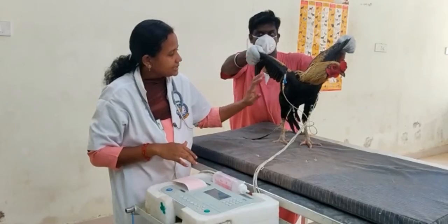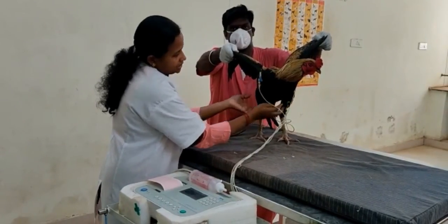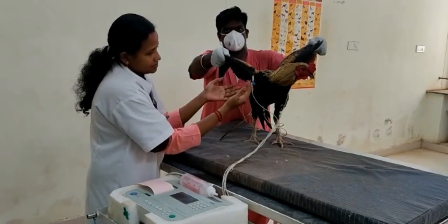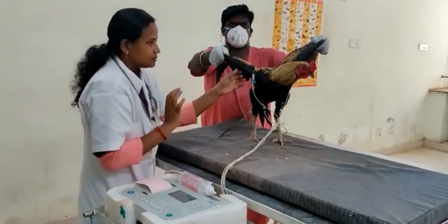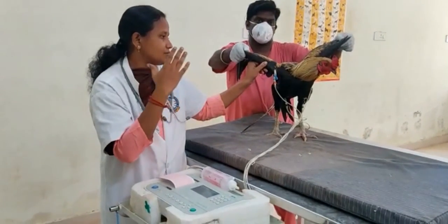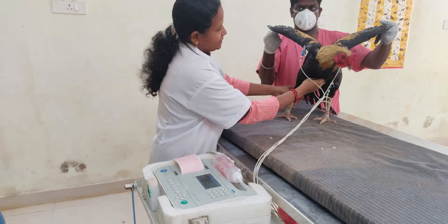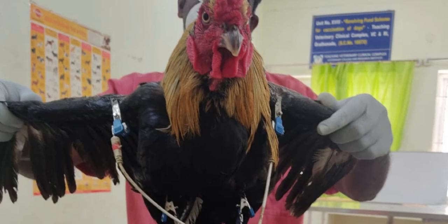To record ECG in birds, the bird is kept in a standing position on an electrically non-conductive area with manual restraint. ECG is obtained via standard bipolar limb leads. Alligator clips are attached to the skin at the base of the right and left wings and the right and left thighs, and ECG is recorded as per the standard protocols.